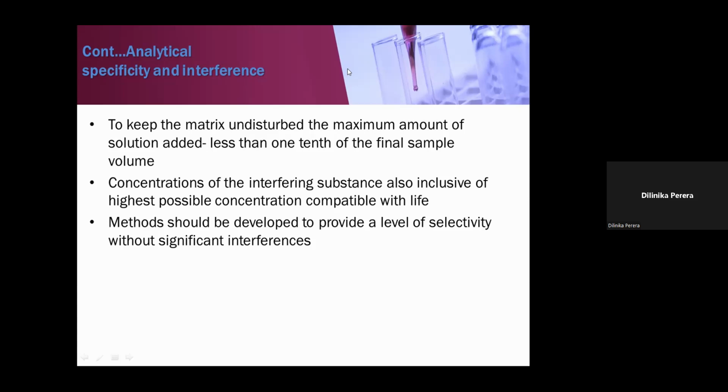If it is available in your analysis, please activate it, and it will be really easy rather than looking at each and every sample subjectively. So we can prevent problems, ask for a fresh sample, or send the report with a comment.